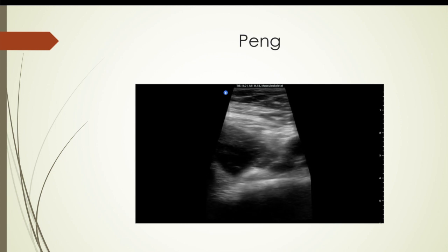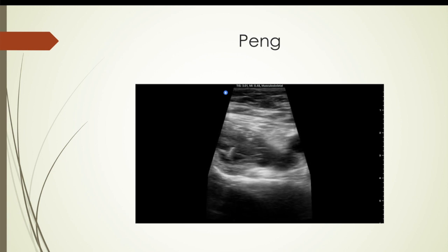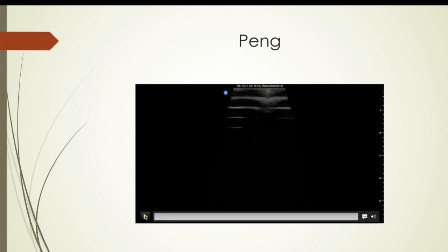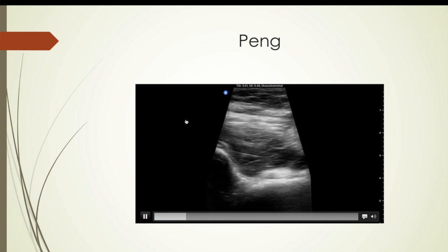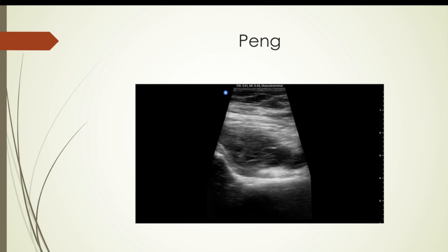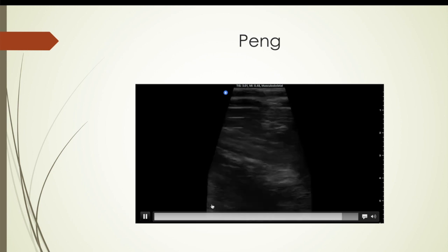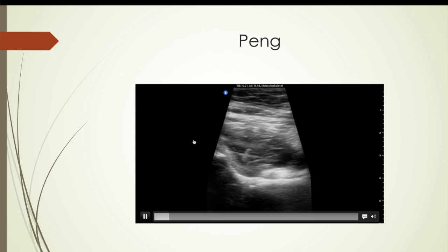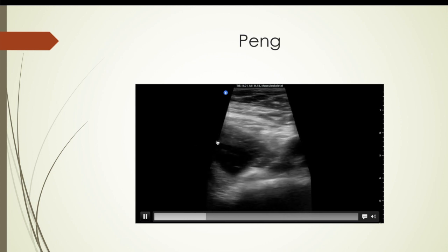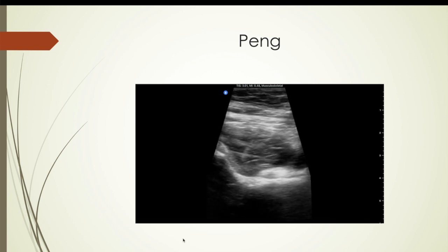Here is a PENG block. For those who haven't heard of it — I used to do a lot of fascia iliaca blocks in the ER and surgery for hip dislocations and fractures; they worked really well, especially for older patients who don't need narcotics. The PENG block is supplanting the fascia iliaca block and works more reliably for pain. You can see the anterior superior iliac spine, the anterior inferior iliac spine, the femoral artery, and where you inject the local underneath the ligament — the patient can be pain-free for up to 18–24 hours.